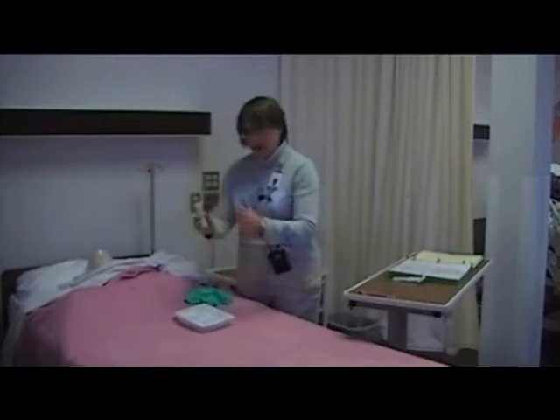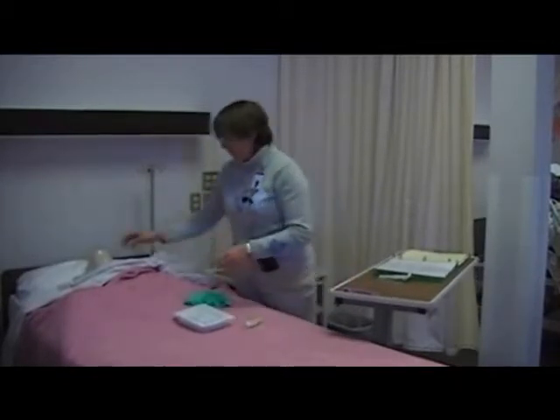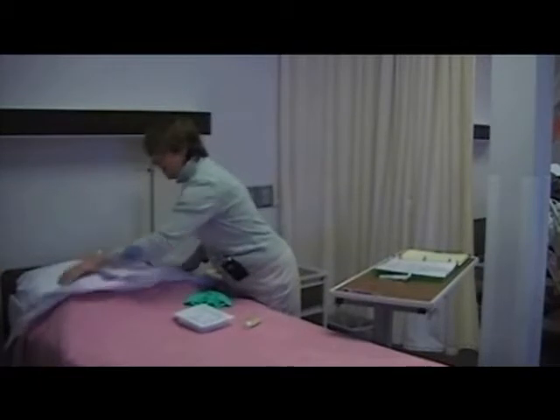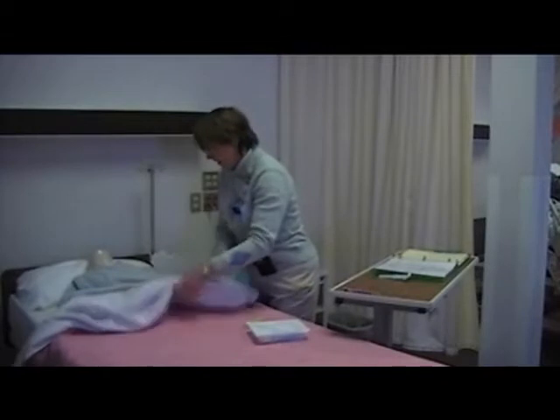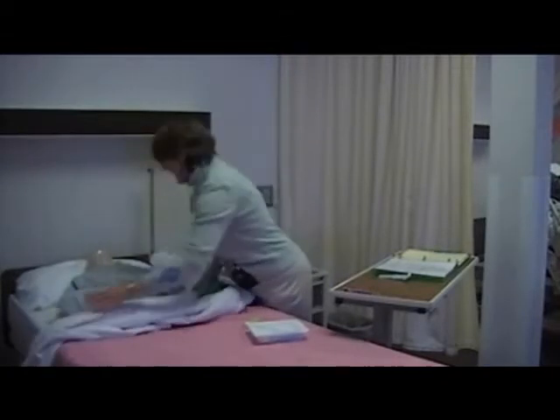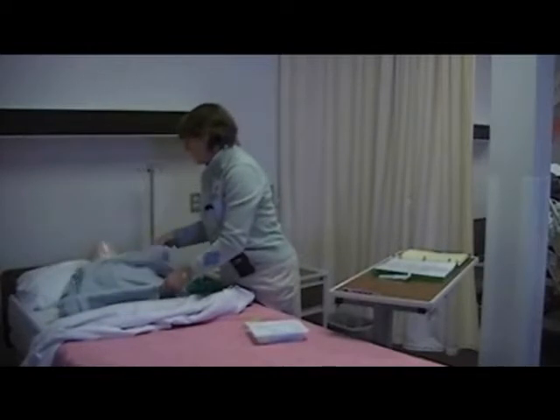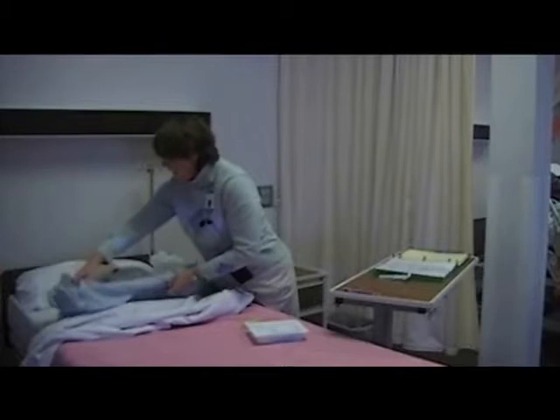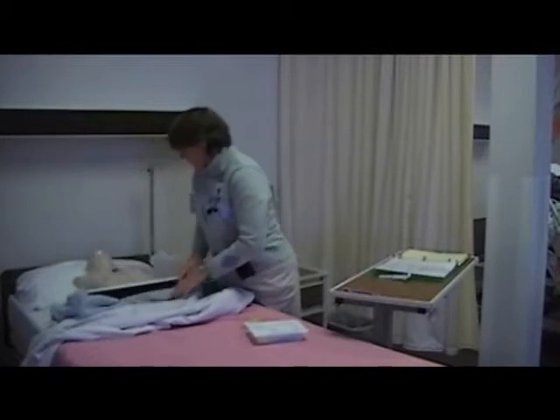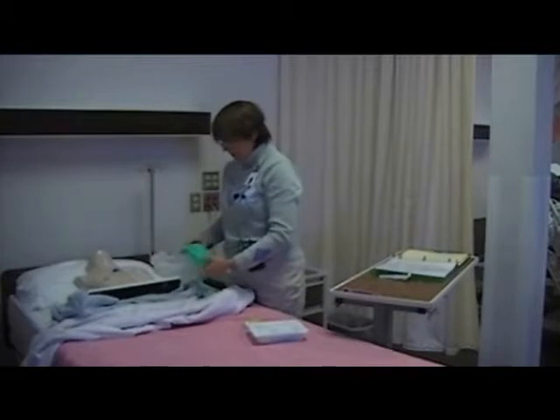Okay. So I have gone ahead and I've washed my hands with soap and water. I'm going to peel back the bedding, and I've talked to my patient. I've identified him. He knows who I am. I've told him I'll be changing his dressing today. And have you had any trouble before when they've done your dressing change? He says no. Are you allergic to anything?